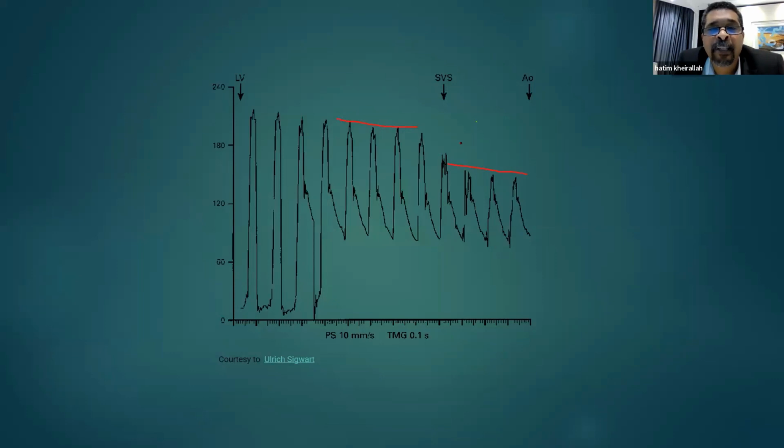So now what I am seeing is an aortic gradient. Aortic gradient. Yes. So that is coarctation most likely. If you say supravalvular aortic stenosis, might also be right, but this is an aortic gradient.